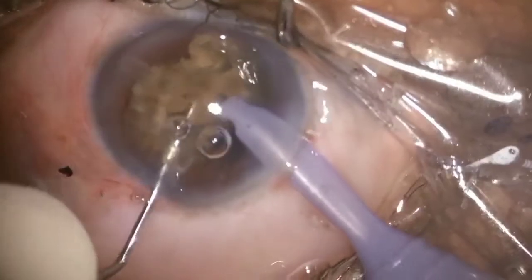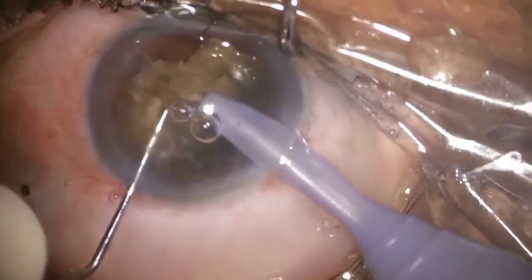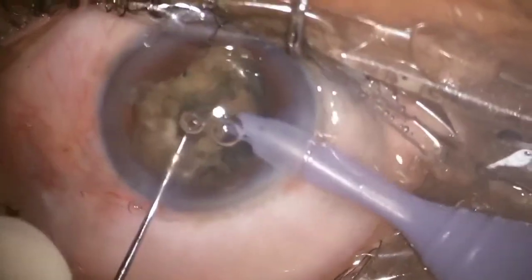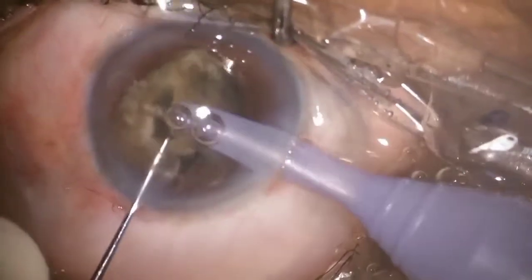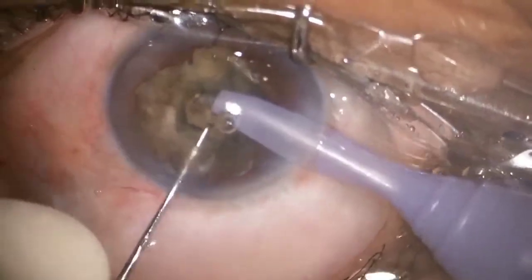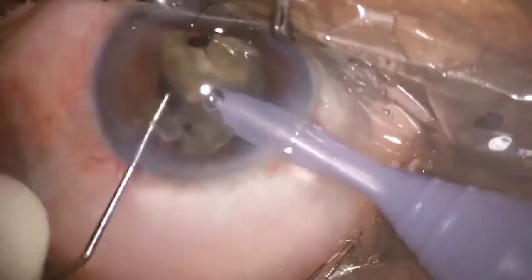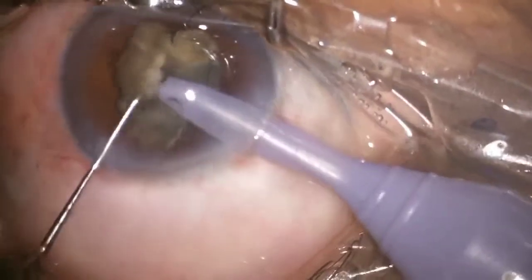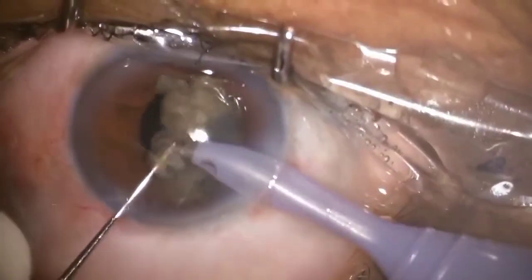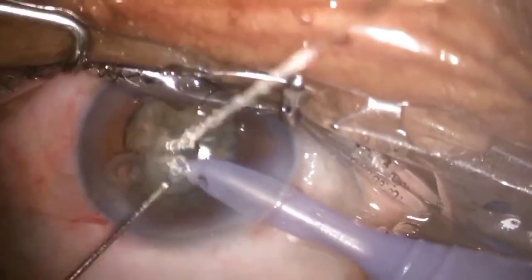But in terms, I was putting the visco in the AC also at frequent intervals, so that least injury of the endothelium occurs. And again, since it was a very hard cataract, and the fibers in hard cataracts are hard to break, it took me a lot of time and a lot of energy to break it.